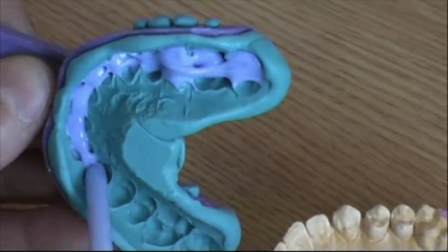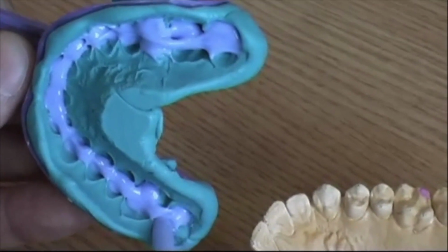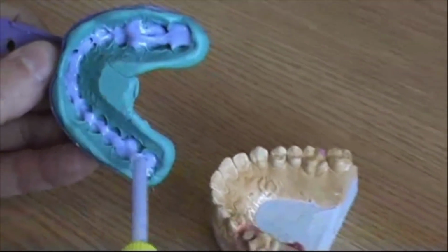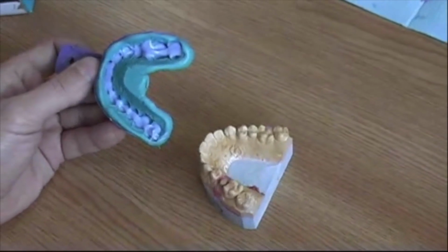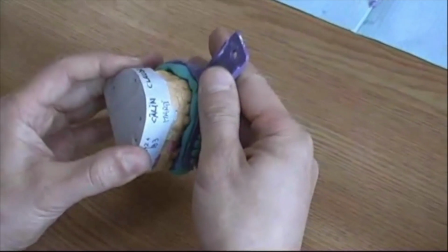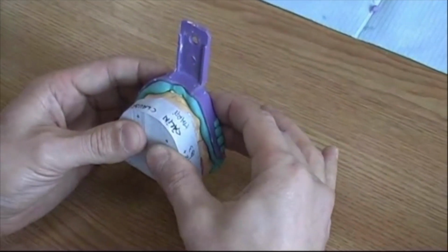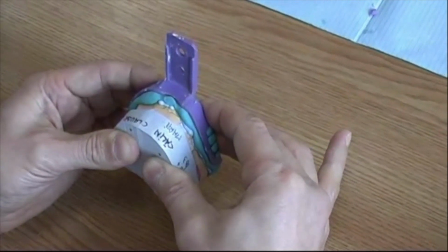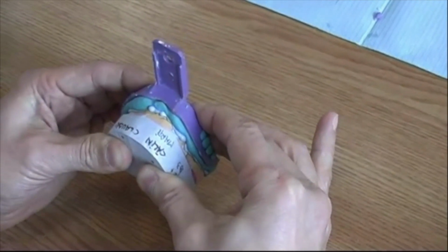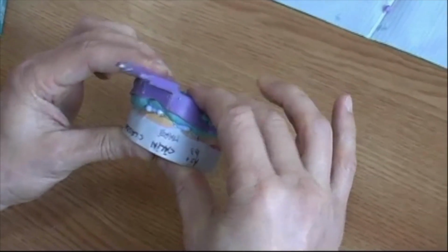You'll say, why the neighboring teeth? Well, that's important because you need to have a very, very nice aspect of the occlusal surfaces in order to be able to combine the upper and lower model and to get the best occlusion possible. Okay, and we do the same thing. We place it again slowly, not much pressure, slowly, and then if you press a little bit more, okay, then you relieve the pressure and you stay like this. That takes around 3 minutes.